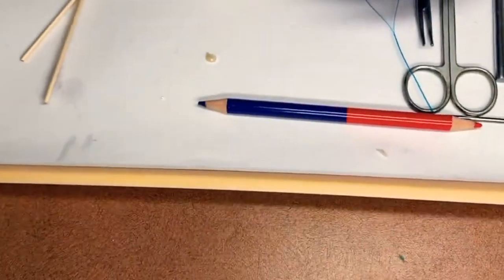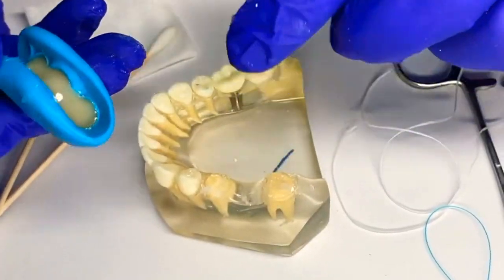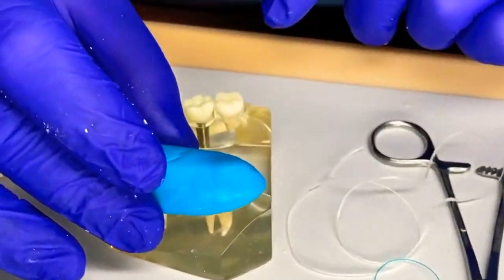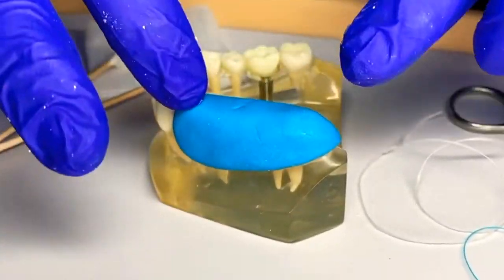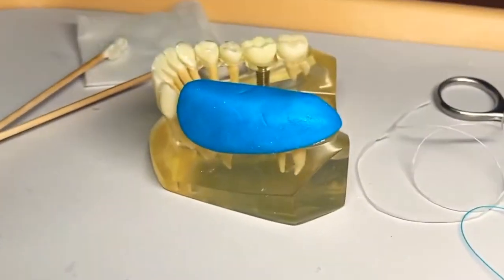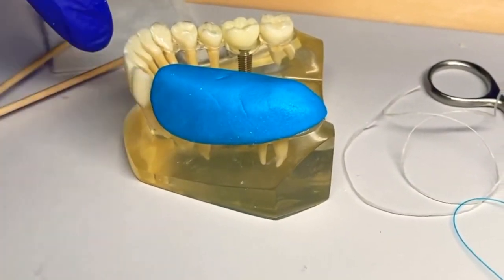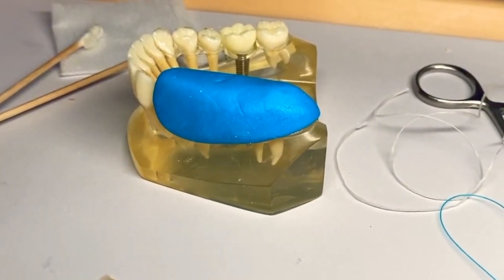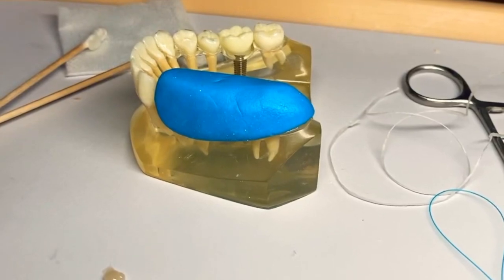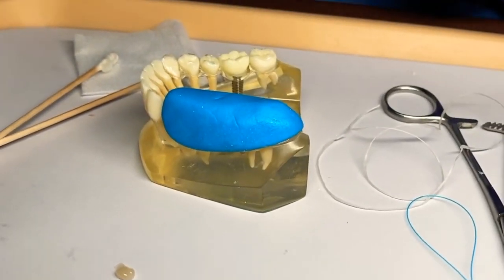We fill it up to where the margins are — we don't want too much extra. We know this is the back and this is the front, so we're going to put this on just like this and gently place it. We don't want to push too hard or let the material squeeze out. We don't want it on too many front teeth — it could lock the temporary on and the doctor would have to cut that off. If it does happen, just tell the doctor and they'll remove it.